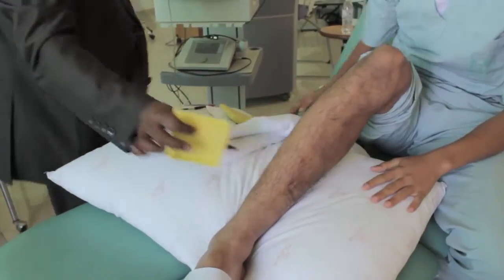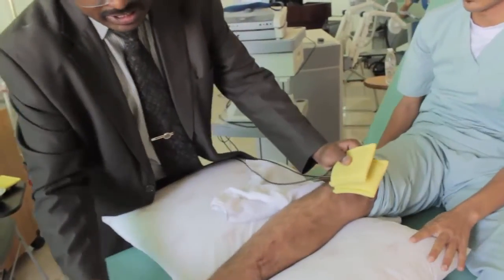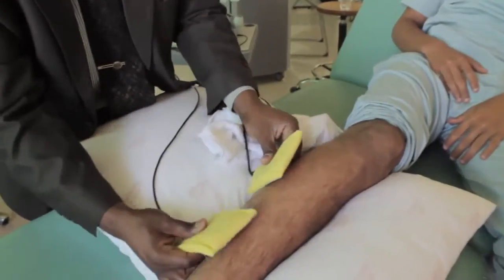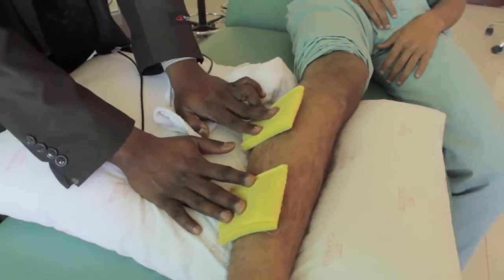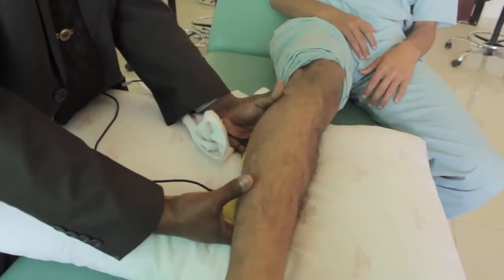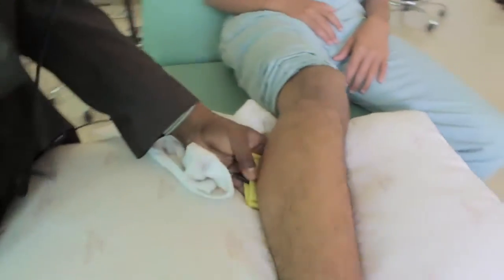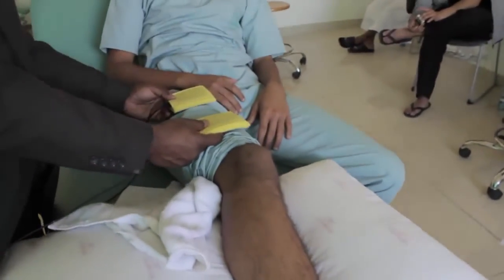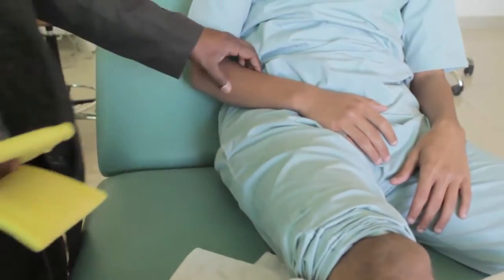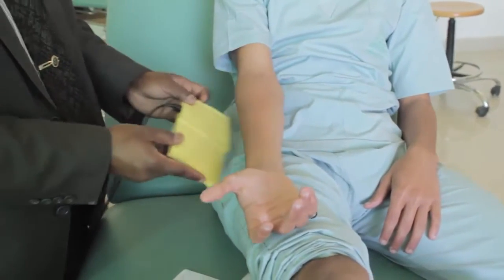So similarly, we have evertors of the foot. When there is a problem with eversion of the foot, go more laterally and keep the two electrodes here. This will be for evertors. For plantar flexors, two electrodes on the posterior aspect, and the patient position is prone. The patient will be lying down on the stomach. For quadriceps, it is here. For hamstrings, it is on the hamstrings muscle. Again, forearm flexors here. Forearm extensors, opposite side.